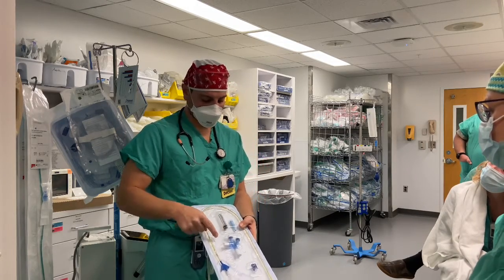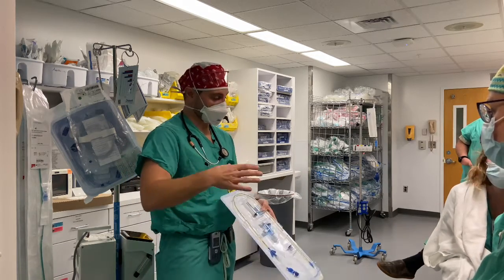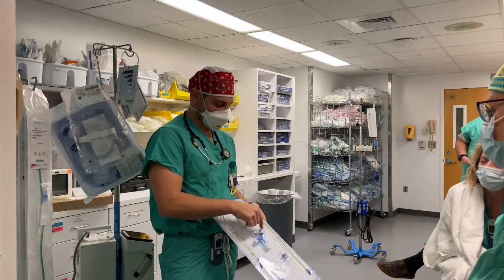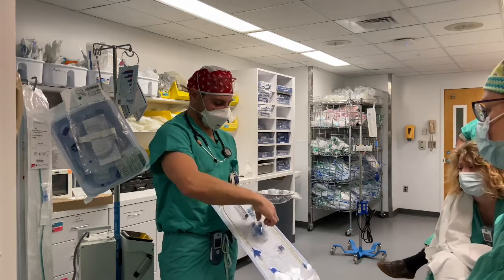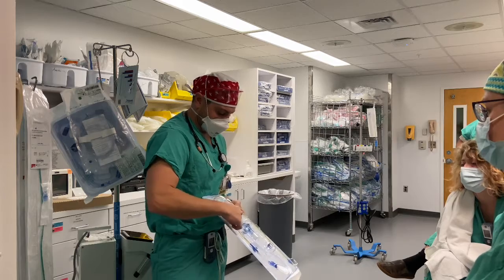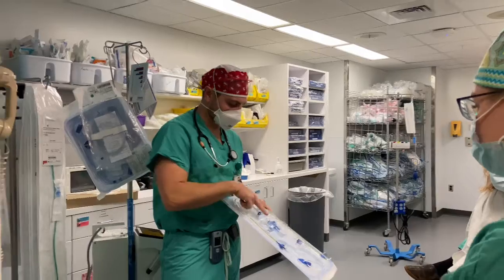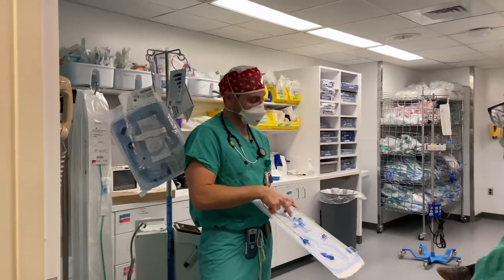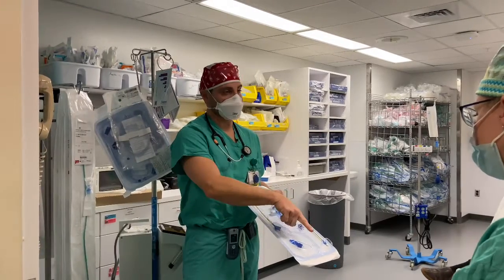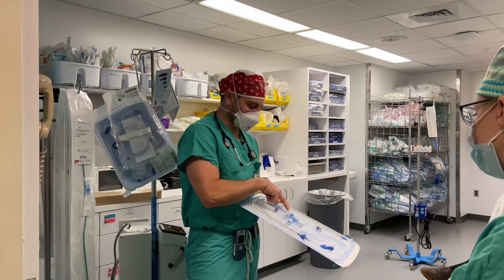And there's 2 additional ports. One that's got a sort of a soft plastic diaphragm that you can put something through, and it kind of gives you a little bit of an occlusive seal around it. And then this thing here that you can pass another thing through and tighten it down so it doesn't move. Okay? So this one, this straight vertical shot, is where you put your fiber optic scope. Okay? It's a straight shot, so you don't have to bend the scope, and it seals around the scope so you can move it in and out without losing all your air that you're trying to blow down into the patient's airway while you're manipulating it. This is the side that the blocker goes through.